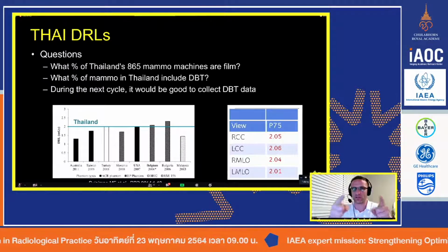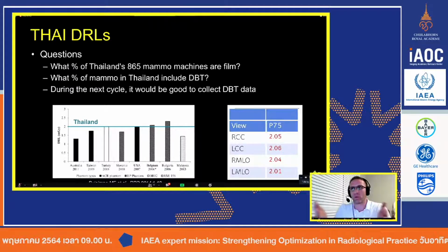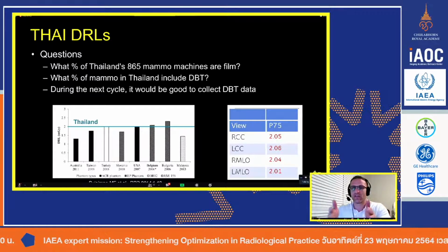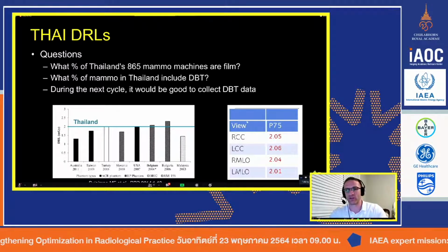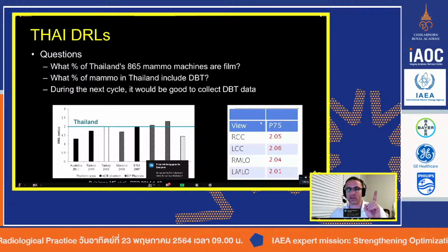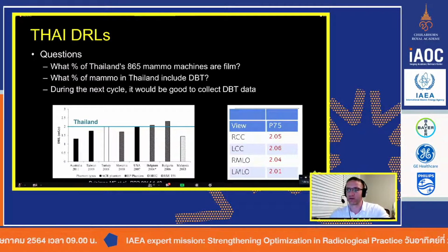So here's my distribution. And maybe that hospital is skewed towards thicker breasts. I don't know why. Maybe they're all 6 centimeters instead of 5 centimeter thick compressed breasts. So then they could check their value and make their value align with that. So there's different ways to approach it. The simplest and most straightforward and best place to start is doing it like this. You get one value for the entire population and start from there.